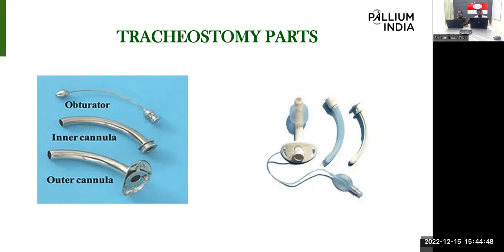As Sony said, if the inner cannula is too short compared to the outer cannula, mucus will obstruct the airway. The inner cannula we can remove and clean any time, but the outer tube remains there at all times, no?